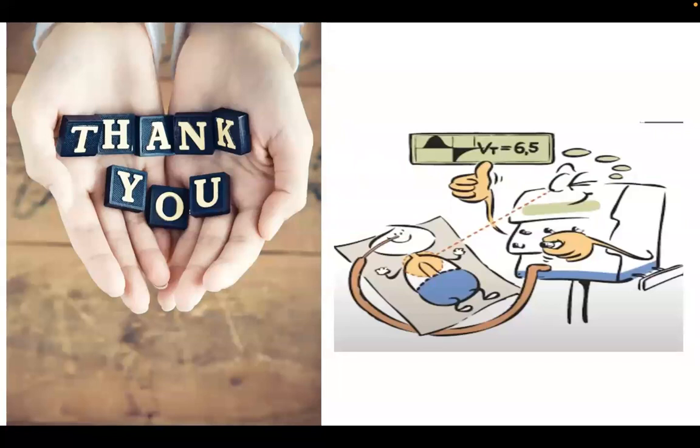In the VN series of ventilator, they will give you the expiratory tidal volume, the inspiratory tidal volume, and another tidal volume. That other tidal volume is what has been delivered to the alveoli. So that is another advantage. Whatever is shown as the expiratory tidal volume is not exactly the tidal volume that is delivered to the alveoli.